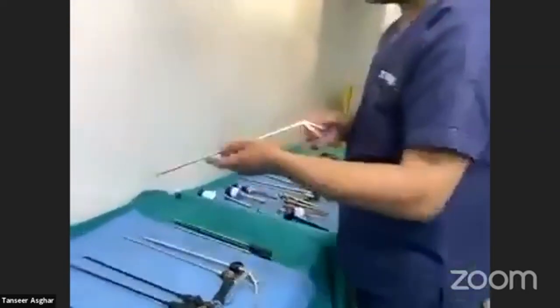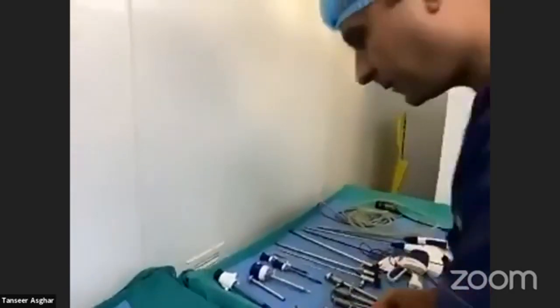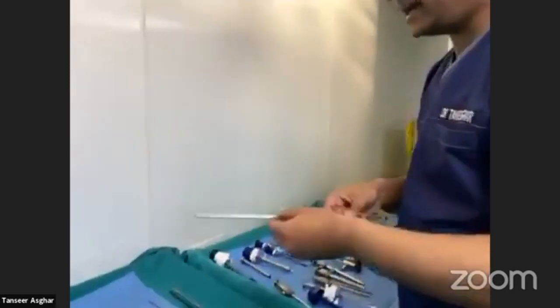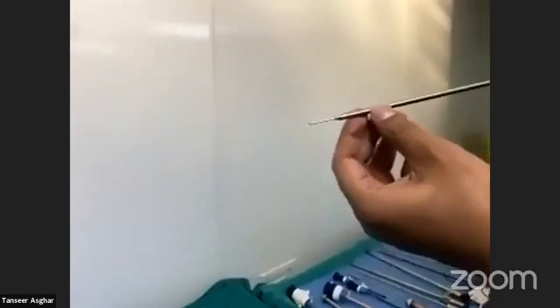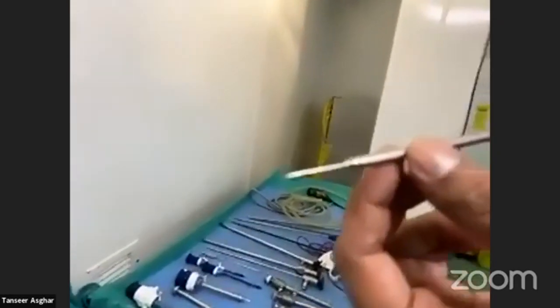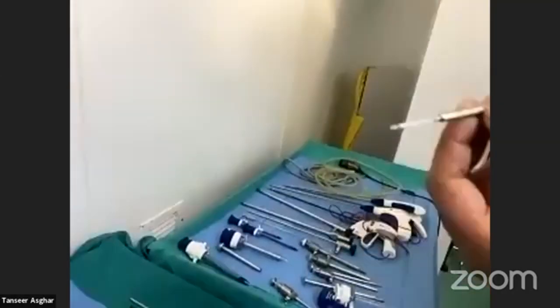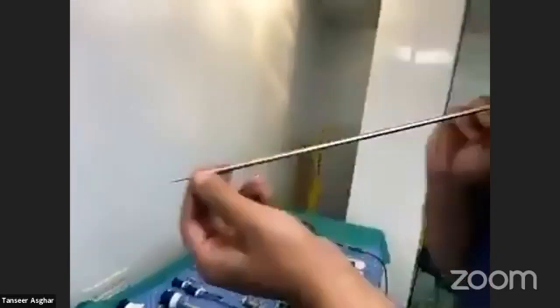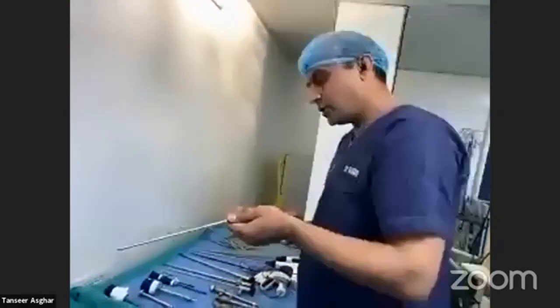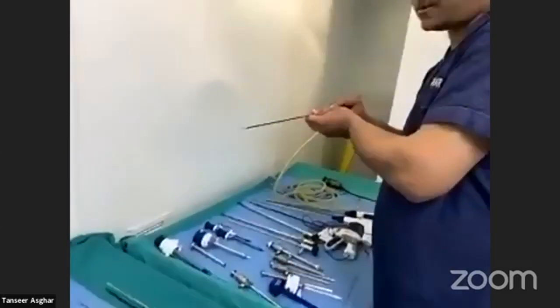This is a grasper punch biopsy forceps. Laparoscopically, if you want a biopsy, you just hold the tissue and pull. Here is another instrument — the aspiration needle. When you have a very tense gallbladder, such as in empyema, or a stone impacted at the neck, you insert this needle safely and attach it to suction to aspirate the bile or pus from inside the gallbladder.